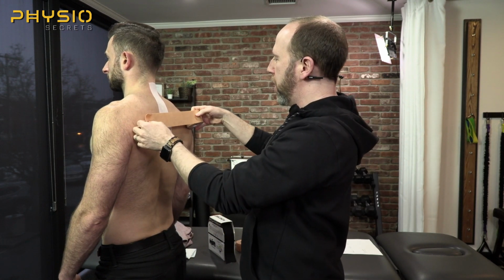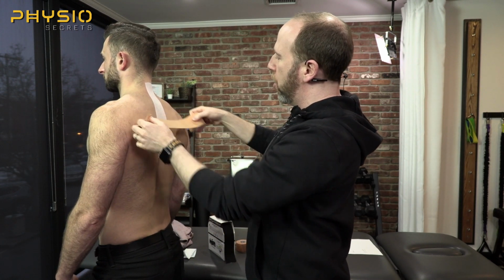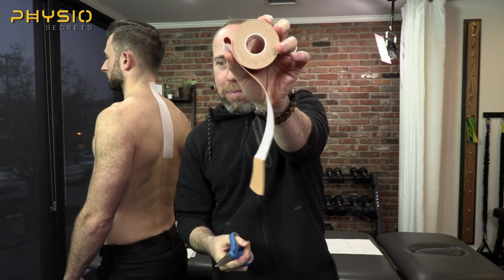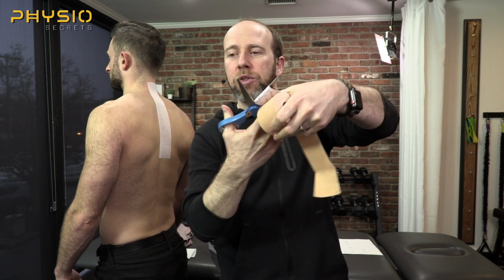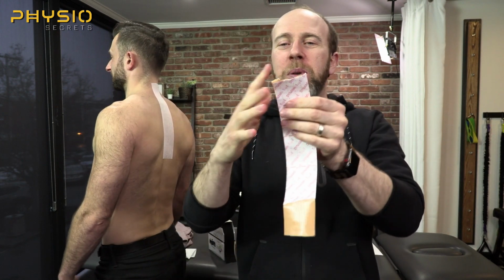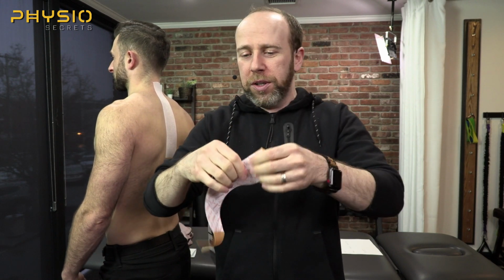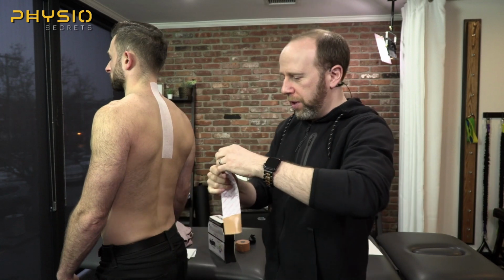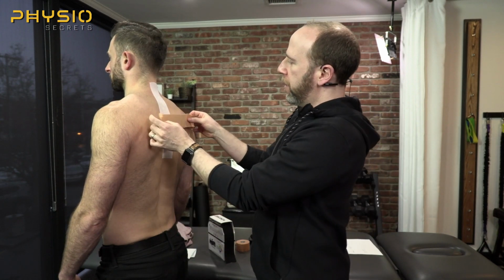So knowing how far the tape stretches, and this just takes a little practice getting to know the tape, I'm going to back off about 25%. Again, fold your tape backwards before you cut it. Stick the scissors all the way in so you get as clean a cut as you can. All right, then you would do the same thing here. You're going to cut the corners, but I'm going to skip that for now just to get through this.